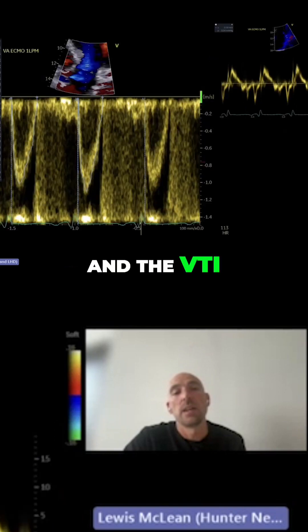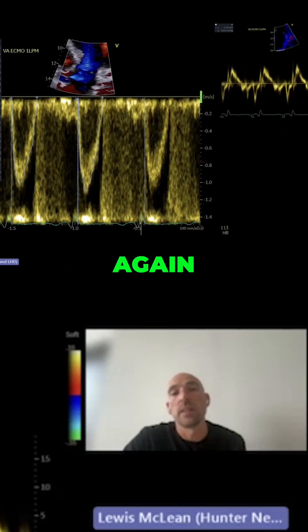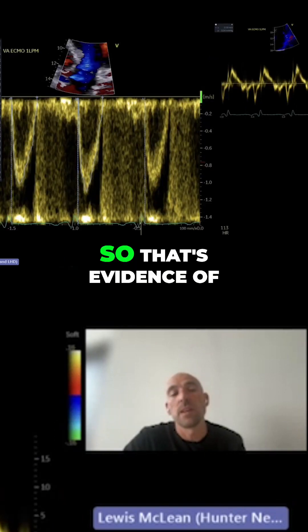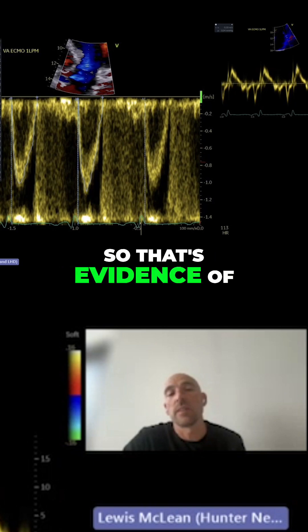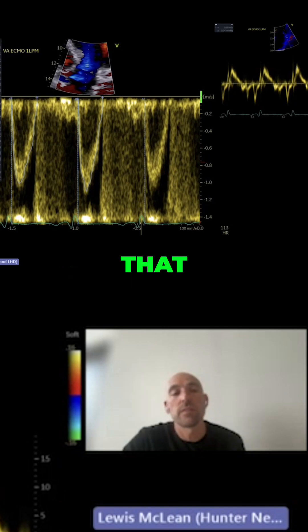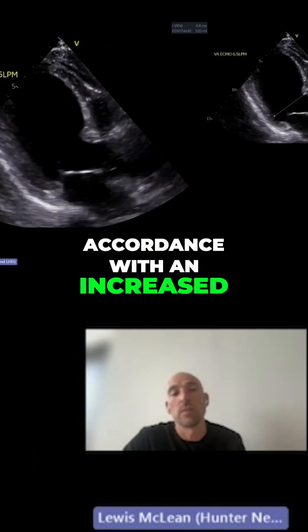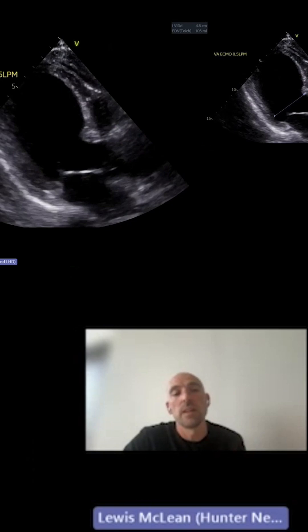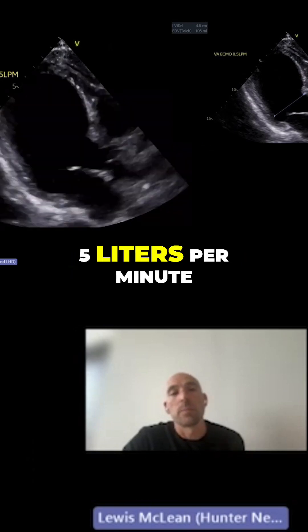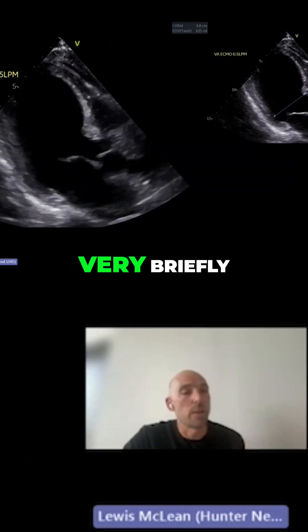The VTI is up to 14.1 — that's evidence of contractile reserve. Stroke volume has incremented in accordance with an increased preload. Down at 0.5 liters per minute, we'll often do this very briefly.